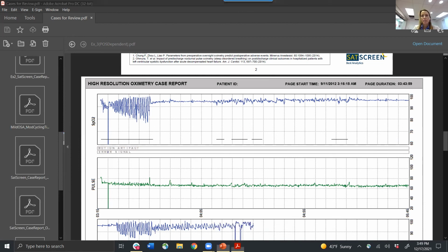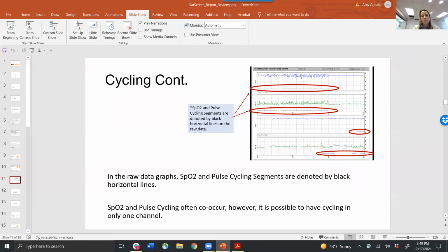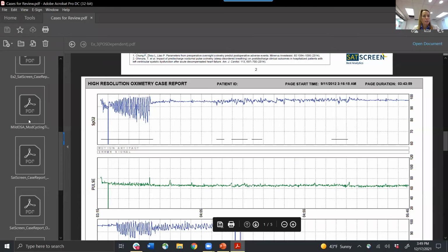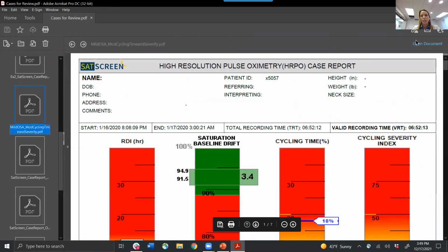And I think that covers that. The last thing I wanted to touch on here today is that I often get questions about titrations or strategies for titrating. So oftentimes when you're titrating a patient, basically you want to get them into the green. There are a couple of different approaches that I've seen practices take, and maybe we have some people here who can open that up for discussion.